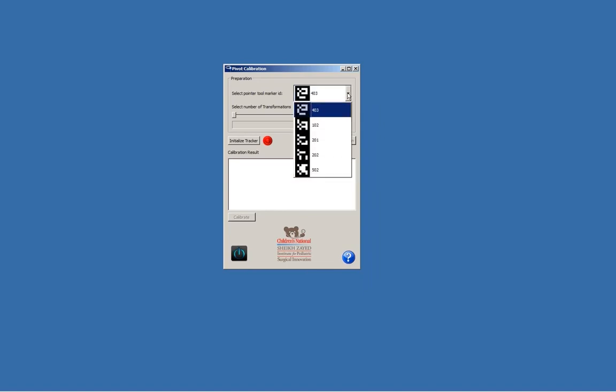I chose marker number 102 and that's attached to a pencil that I'm using as a pointer tool. Now we need to select the number of transformations to use for calibration. 300 is reasonable and is the largest number I can tolerate before I lose my patience.